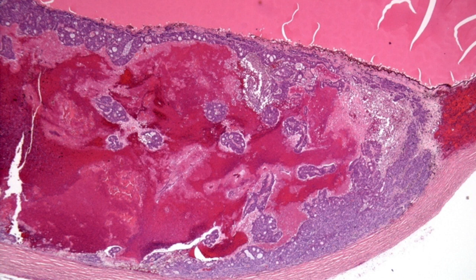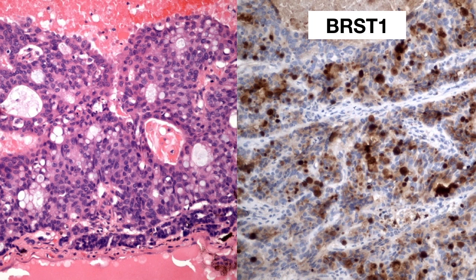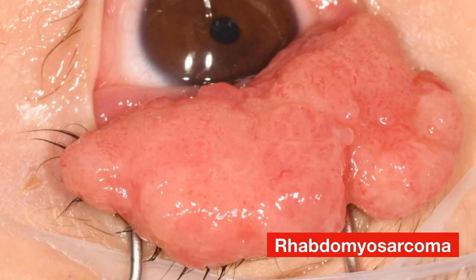Immuno is also used to identify primary tumors that have spawned intraocular metastases, like this metastatic breast carcinoma, which is immunoreactive for breast marker BRST1. Immuno is used to assess a variety of primary and metastatic orbital and adnexal tumors.